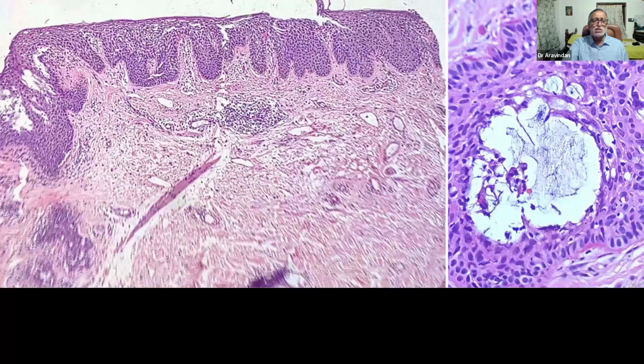This is another case of non-scarring alopecia. It can present as a small nodule. Sometimes it may be hypopigmented. In many cases, I've seen it come with a diagnosis of Hansen's. I don't know how it resembles Hansen's. In literature, it doesn't really mention that. But in our cases, at least, sometimes they come with a diagnosis of Hansen's. And you find these follicles contain mucinous change. And this is follicular mucinosis. And it can be associated with alopecia.